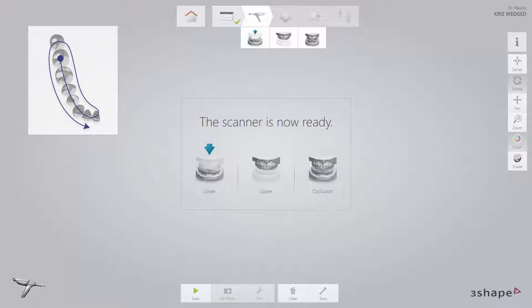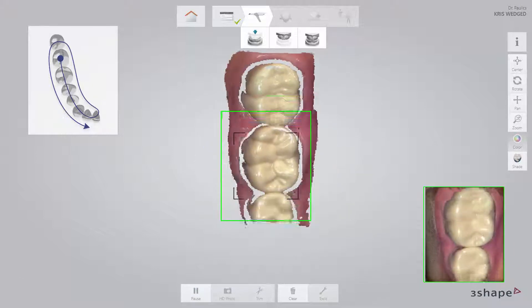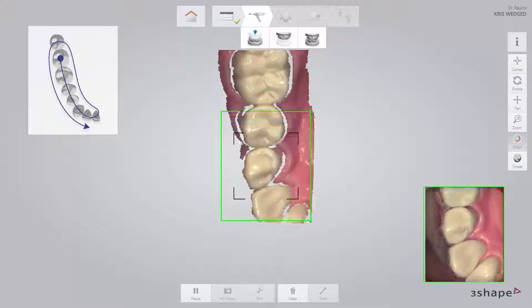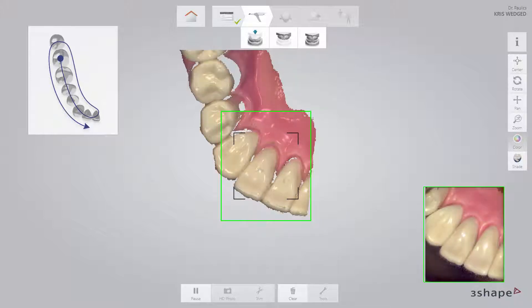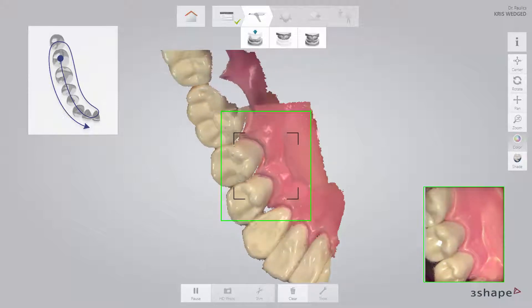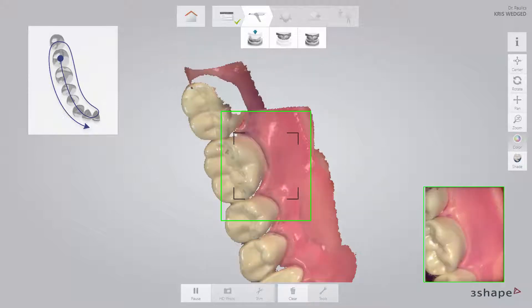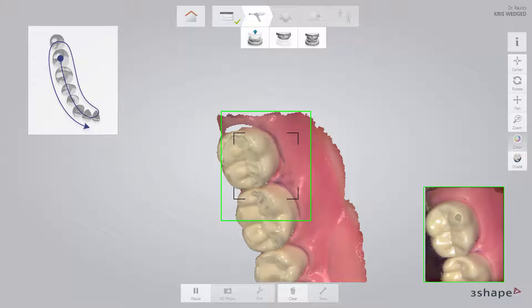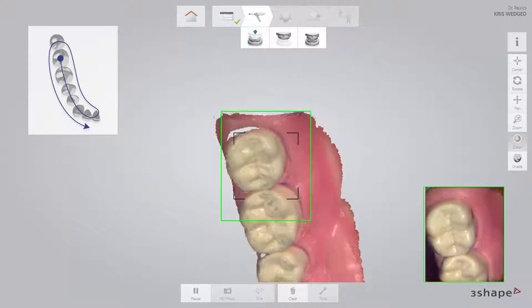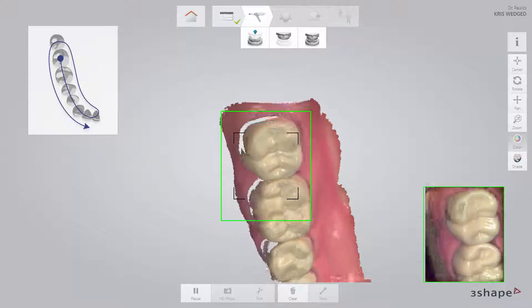Follow the official scan strategy: start by scanning the occlusal surface from the molar to the canine. Then, as it is the lower arch, slowly roll to the lingual side and move the scanner in the distal direction. Finally, slowly roll over the last molar and scan the buccal side.